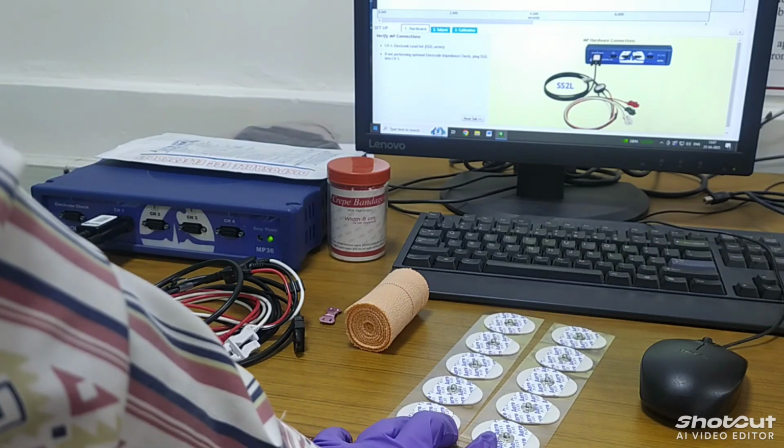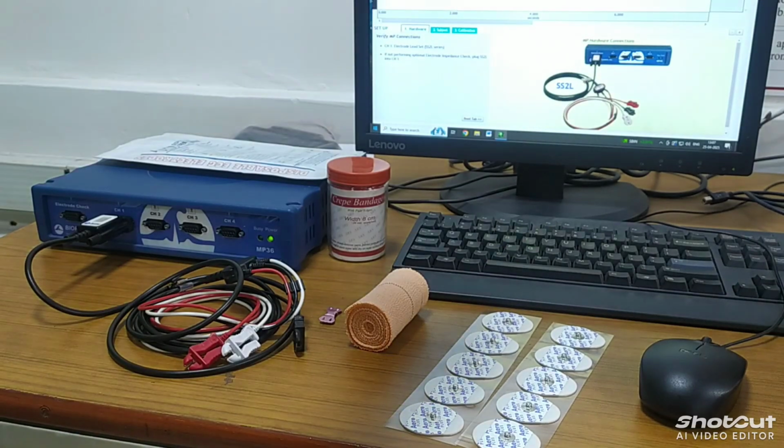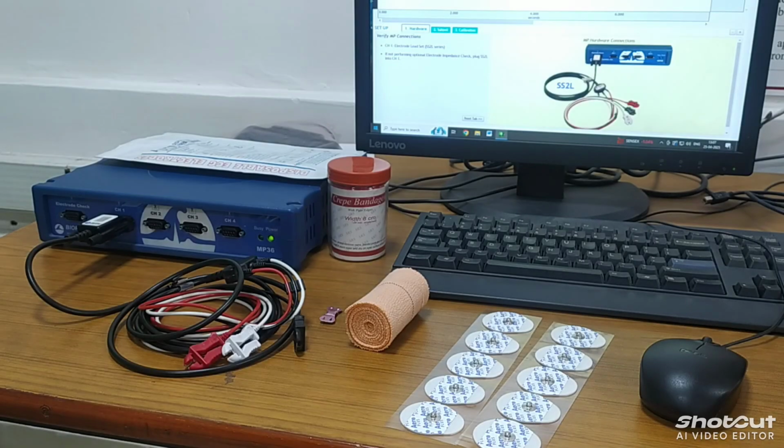And these are your disposable electrodes, and your display has an interface with your PC. So these all are the basic components which we require for performing the EEG experiment.